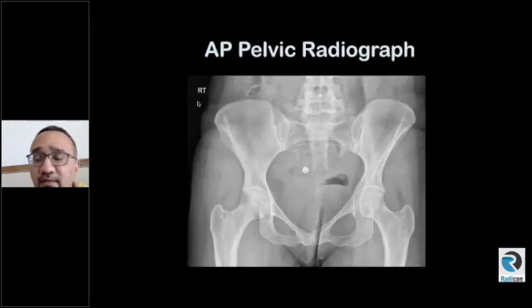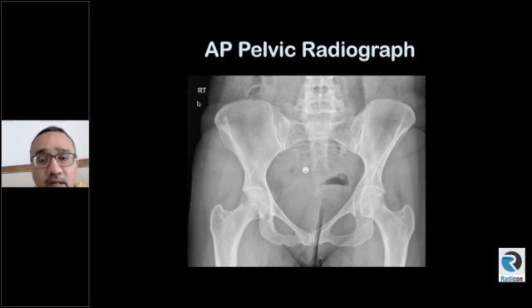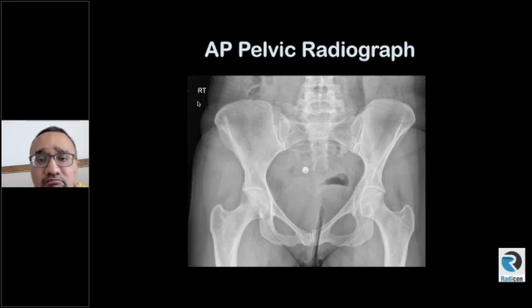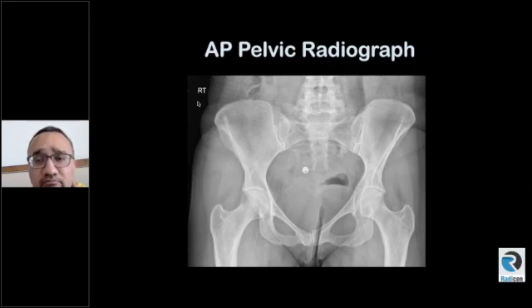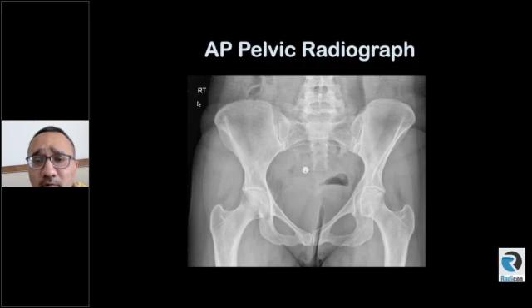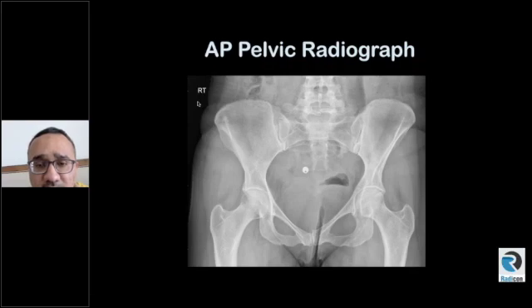Let's start with the AP pelvic radiograph. This is an AP pelvic radiograph of an adult female demonstrating mild degenerative changes in the pubic symphysis. The sacroiliac joints appear symmetrical, and there is a mild form of spinal dysraphism at L5. There is an opacity projected over the right inferior sacrum, which is most likely an artifact.